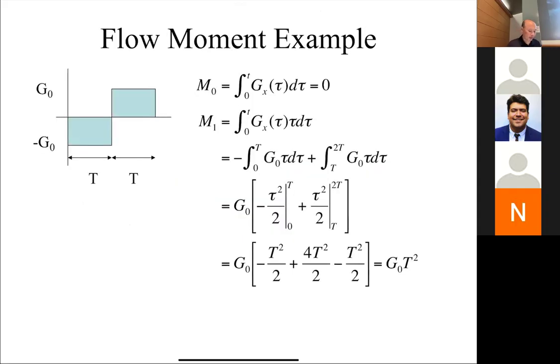So let's take a look at what that first order moment looks like. Remember, these are typically called bipolar gradients. Typically we'll turn it on with some amplitude for some time t, then reverse the sign and have it on for the same amount of time t. We want to look at the properties of that pair of gradients.